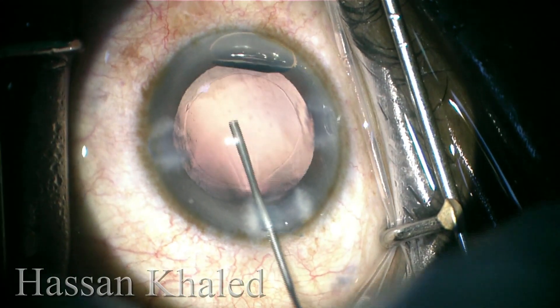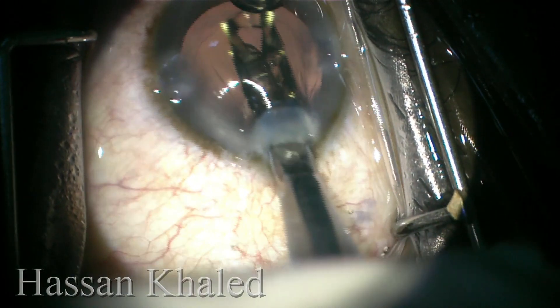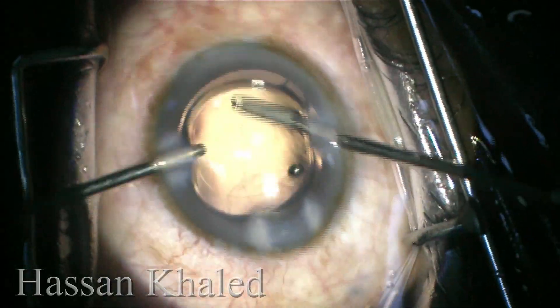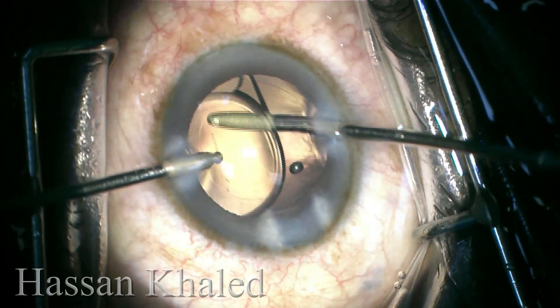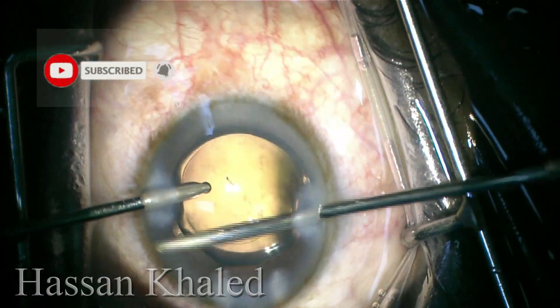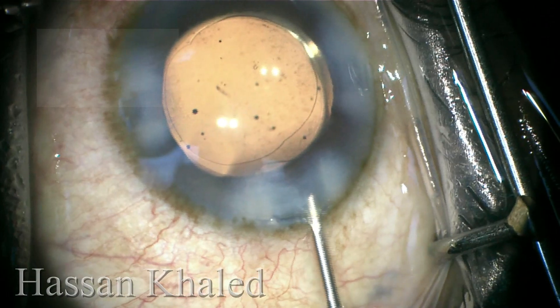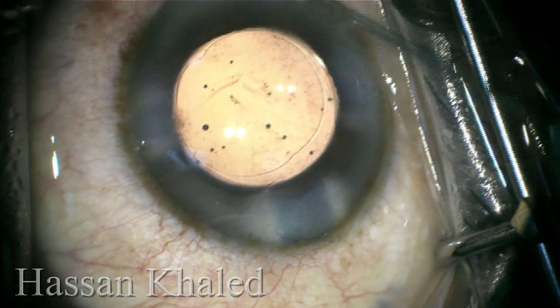Now injecting cohesive OVD to form the capsular bag and anterior chamber, then implanting a single piece hydrophobic IOL inside the capsule. Then washing the viscoelastic anteriorly and behind the IOL to avoid any spikes in intraocular pressure post-operatively. Finally, stromal hydration, and the surgery went beautifully.